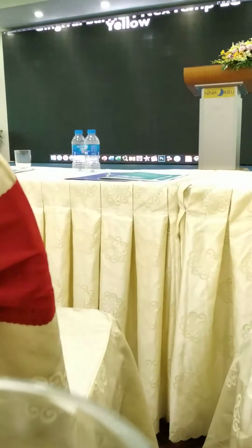Why can we do that? Because when this sealer gets hard, it gets really hard, and the sealing ability is really good. Actually, you can fill the canals just with sealer. The problem is that if you want to retreat a root canal treatment that was filled just with sealer, you will have a lot of problems because the sealer gets really hard.